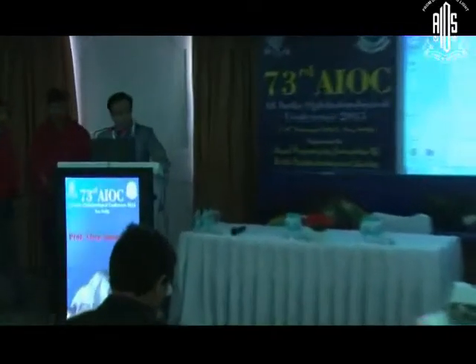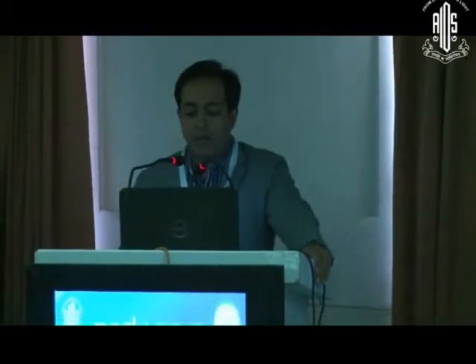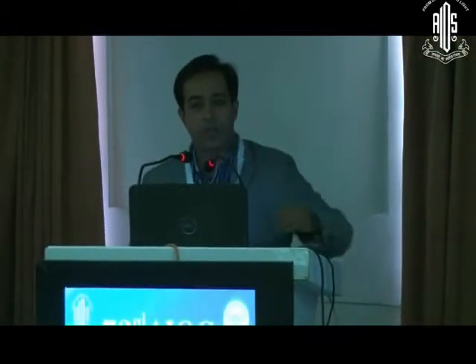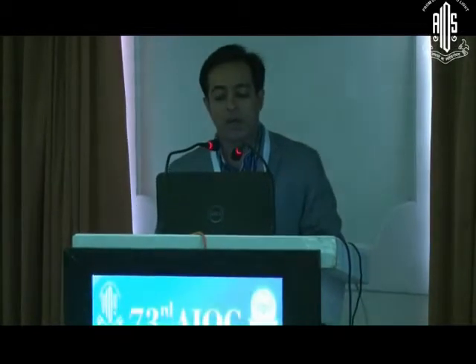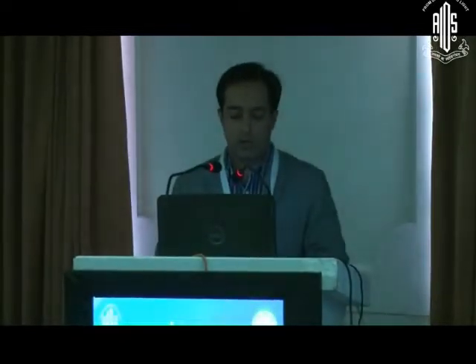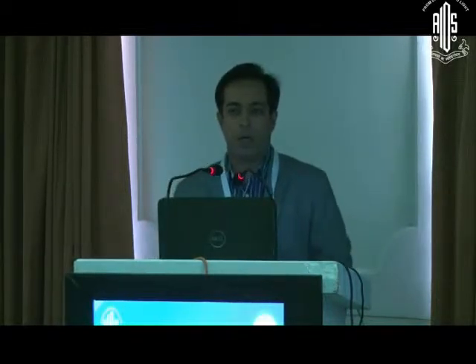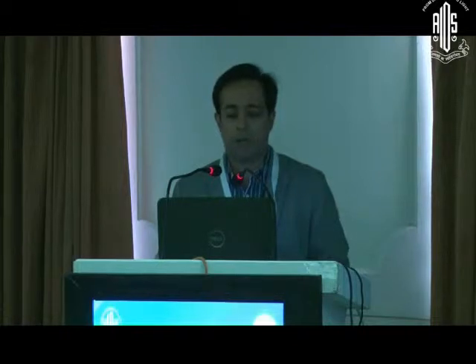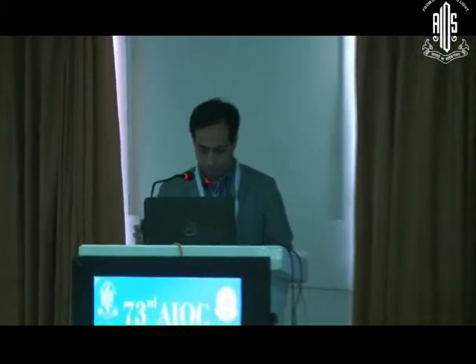I'm going to talk about a few intraoperative situations. Sonal mentioned that, based on diabetic retinopathy situations surgically, we might face some challenging issues during surgery and how we try to work around them. So what I'm going to show you is two cases of tractional detachment, not absolutely typical diabetic retinopathy, but they could be with any kind of vascular situation, and a situation which comes in during that process.